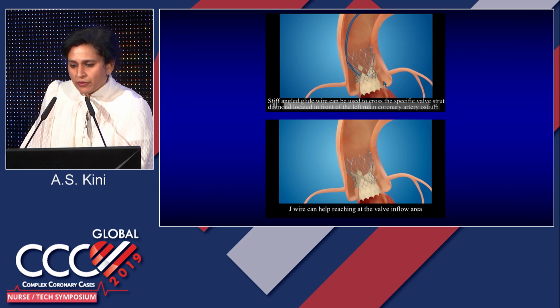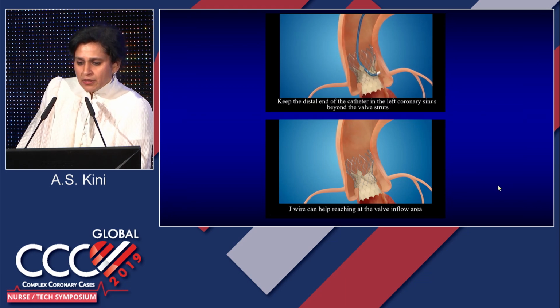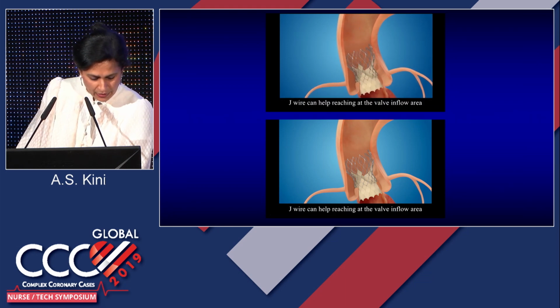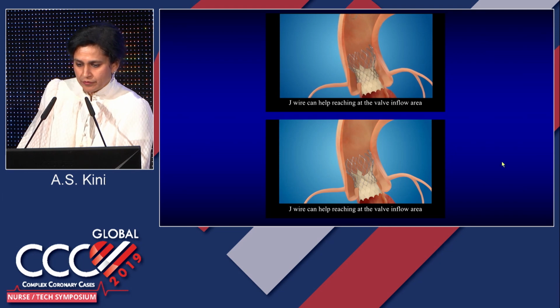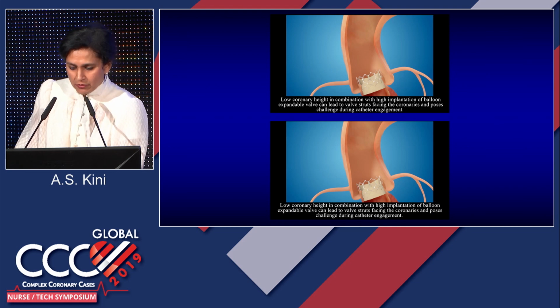So this is the animation we created to show how you can engage this. And this is what is available on that app. This is the left coronary artery, right coronary artery. This is the Sapien valve engagement.